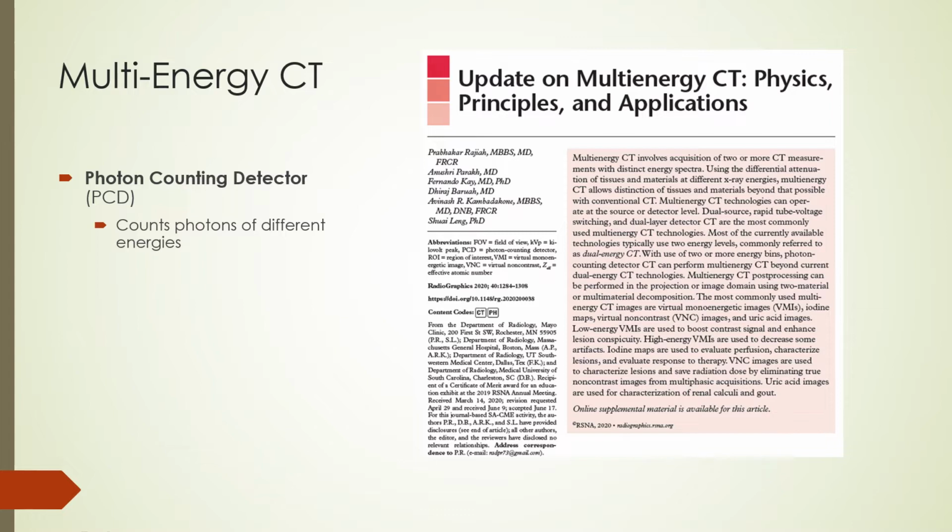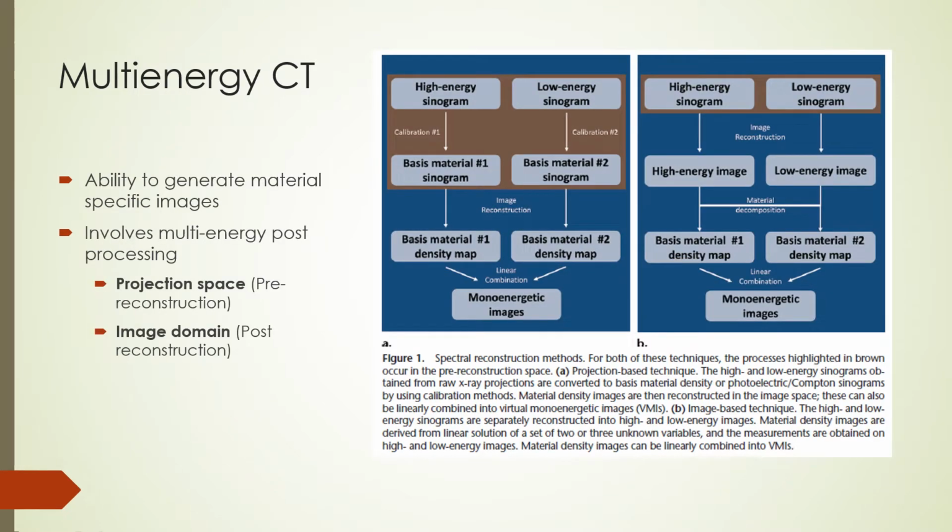This article is a good source of information on multi-energy CT, and the following slides are based on material from this article. Multi-energy CT gives us the ability to generate material-specific images to provide information about the presence, distribution, and concentration of a given material in tissue.